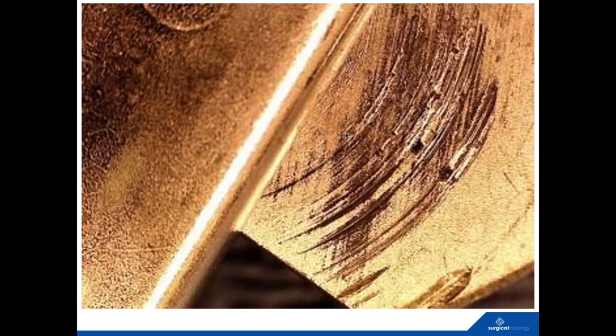But rarely are you going to pick up a scissor that's been on a tray for a while and not see some sort of score marking on it. Would you agree on that one, Bob? 100%.